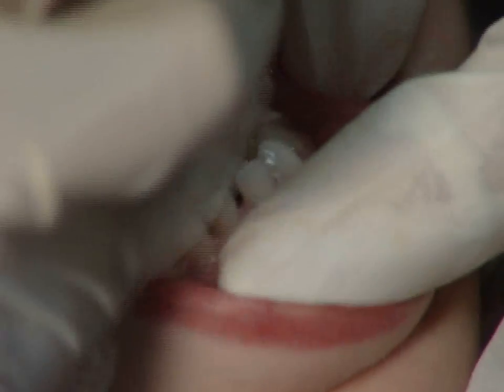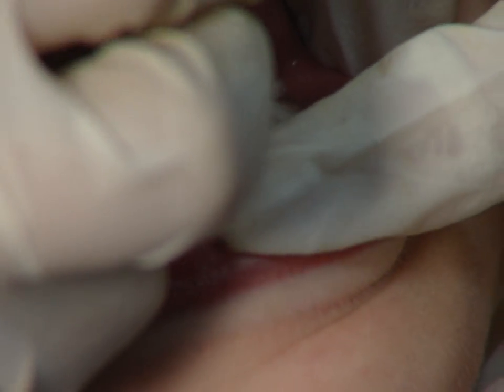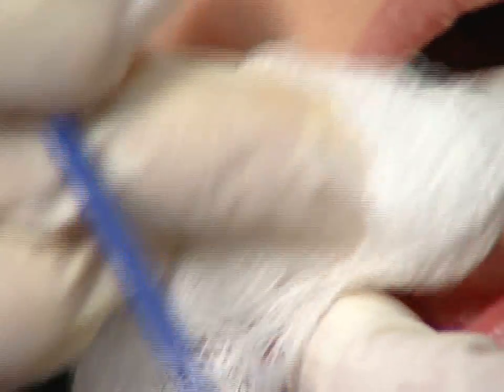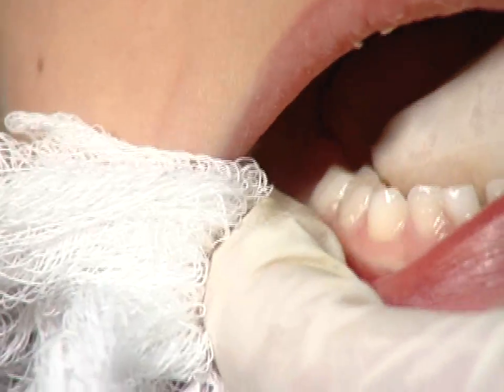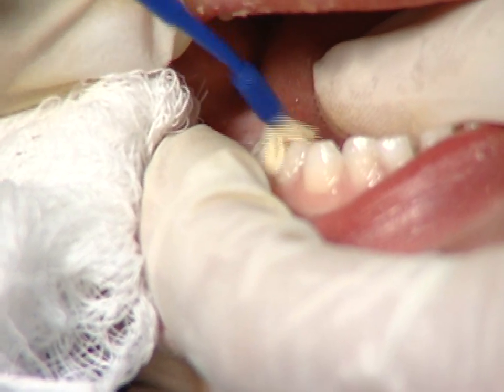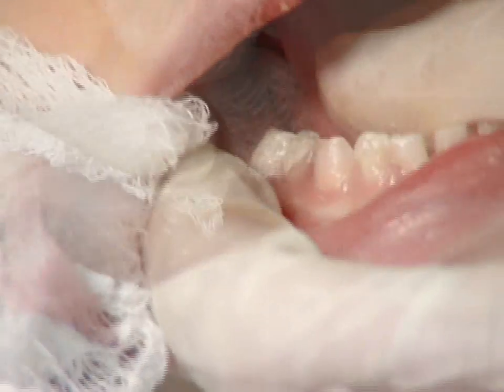When finished, move down to the lower left corner of the mouth. Again, dry the teeth and hold the tongue and cheeks out of the way, and paint on the varnish. Move across to the right side and do the lower and upper corners of the mouth. Frequently, we do not do the lower incisors, as they rarely get cavities.